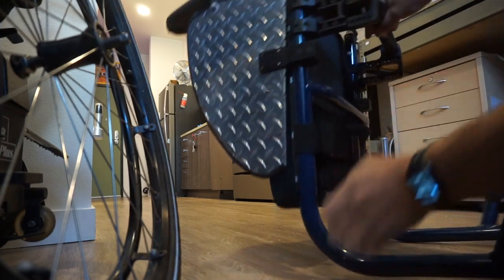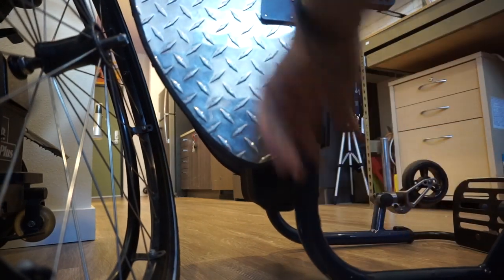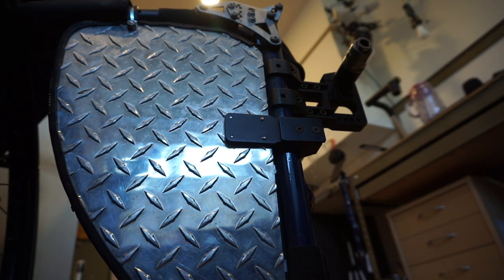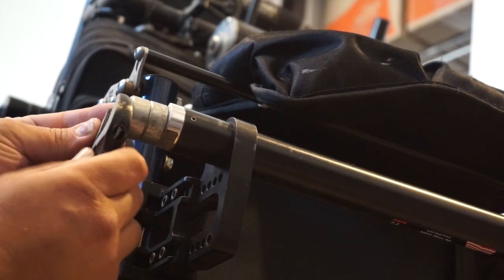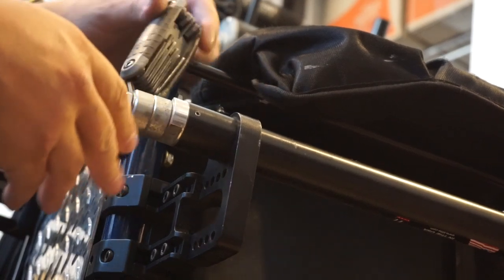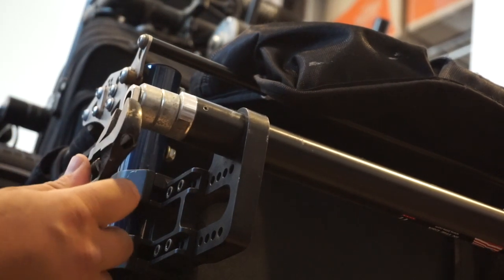The further you have this spaced out, the more likely you are to break the actual axle tubes in here. I also really need to get some impact guards for the front of this chair — it got really scratched up. That wasn't from me; I was traveling a few years ago and some people threw my chair in the back of a truck. I make sure my chair is handled more carefully now. We're going to pull the actual tubes out and inspect them to make sure they haven't broken. I don't think I torqued down the set screws.